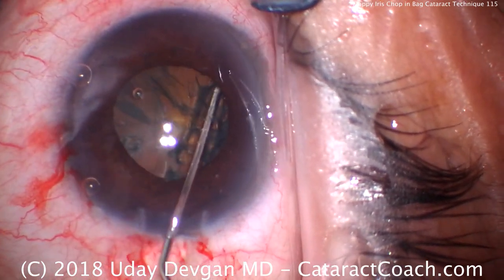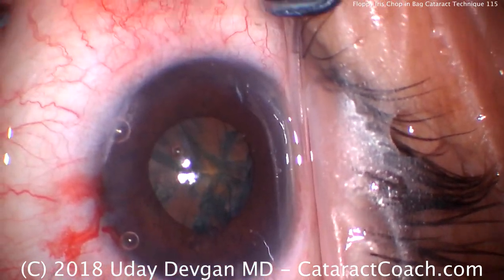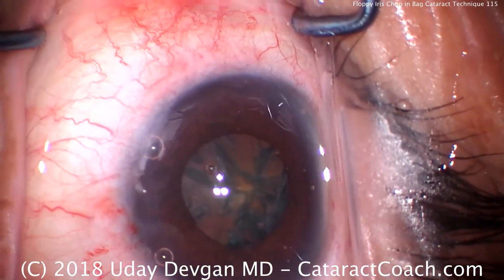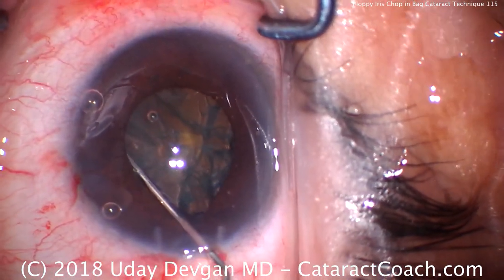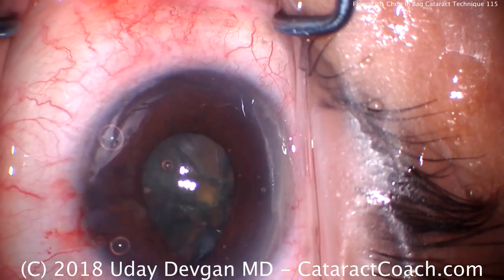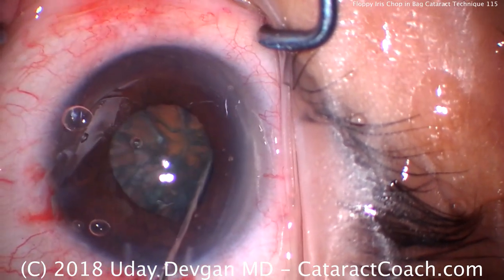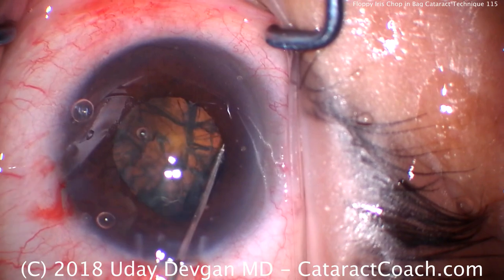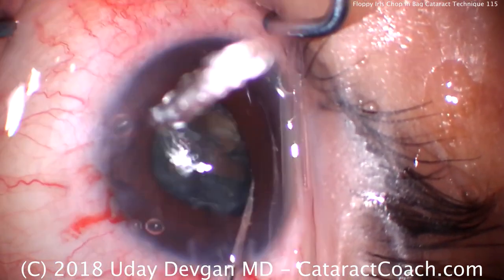We'll do enough hydrodissection so we've really freed up the nucleus and we can rotate it. A little more hydrodissection in the other meridian — I really want to make sure this nucleus is free and mobile. The iris is already starting to prolapse at the incision there. Rotate the nucleus a little bit. Not getting the best rotation, but I think it's sufficient. A little bit of rotation and that'll do it.